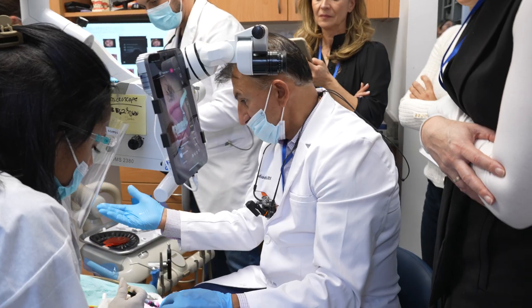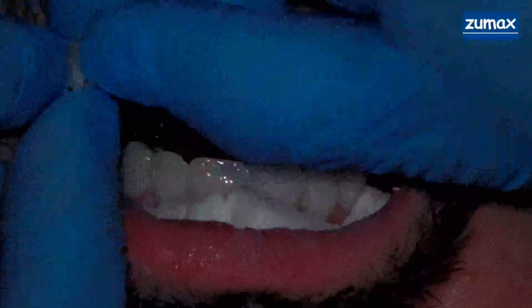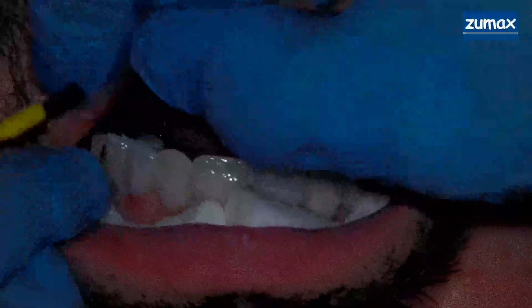Okay, Federico — bonjour from France. Number 12 and that's it. Number 13 was not a good fit so we're not doing 13.